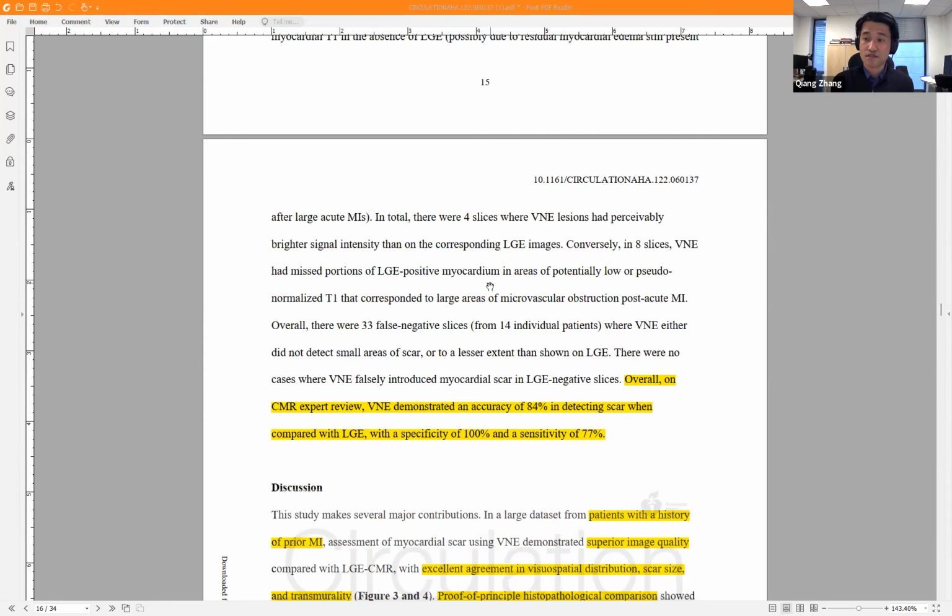And also we noticed that the pre-contrast images such as cine images and the T1 map many times are of better quality, because they come quite at the beginning of the scan protocol, as compared to LGE, when the patient is getting fatigued, and there might be more motion artifacts and other artifacts. So this benefits the neural networks as well to produce better image quality.